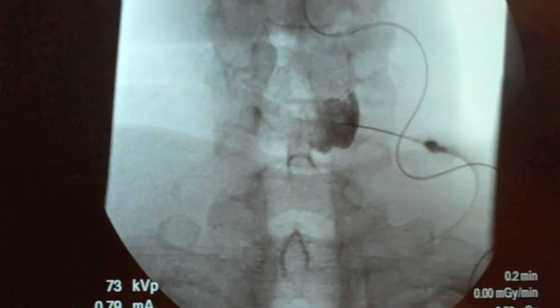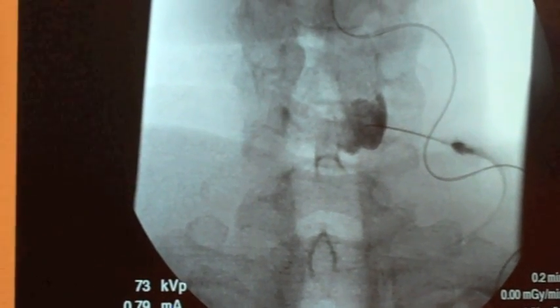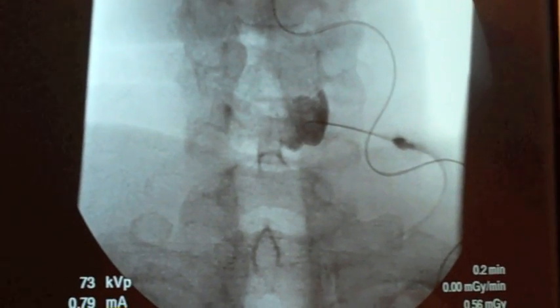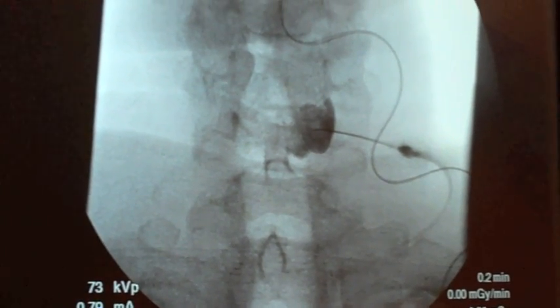Then I'm going to do a test dose of lidocaine. There's the lidocaine. You're going to see that medicine spread as well.